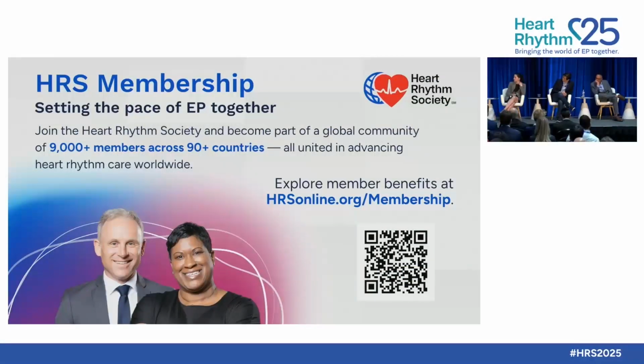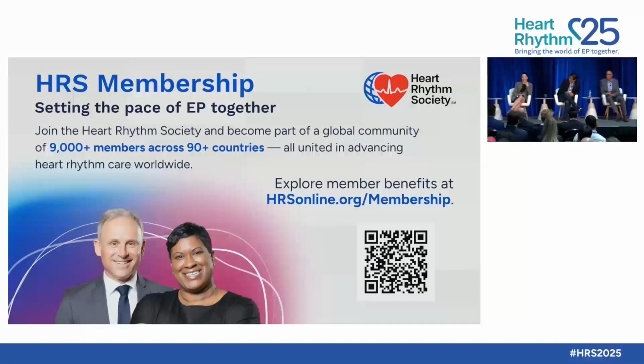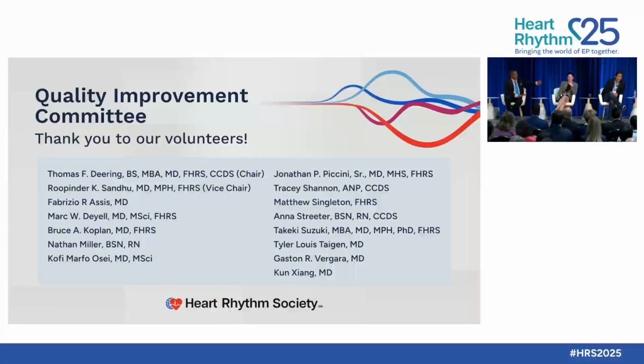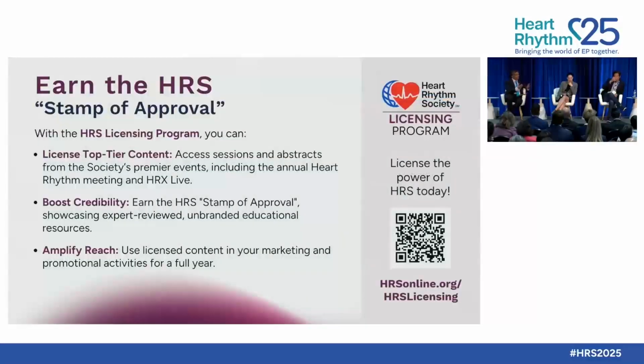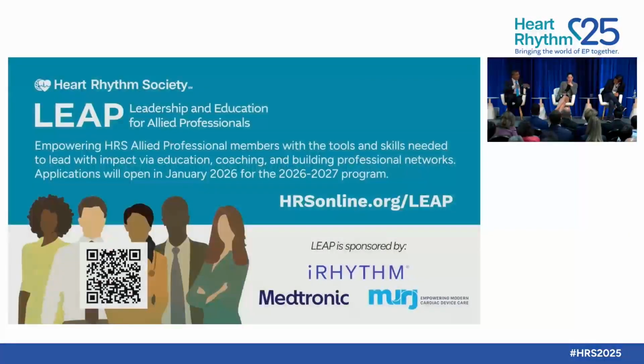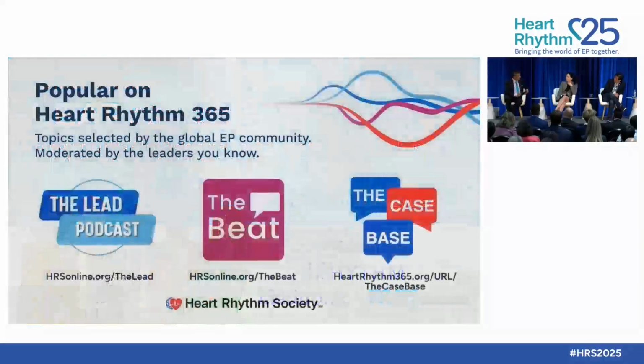Let me just start there. There is no ground truth. Unfortunately, the only ground truth we have is a relatively blunt approach, which is a prospective randomized trial with 1-year follow-up. That's the difficulty, and that's why our whole field, I believe, has been moving so slowly. Having said that, there are certain markers you can use that will move us closer. For example, if doing something causes an effect in the atrium, like prolonging cycle length globally, or certainly terminating AFib, that suggests that may be an important area. So I'll start there, and go ahead, please, Tina, if you want to continue.